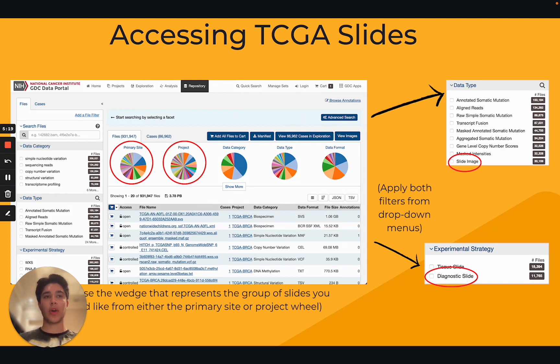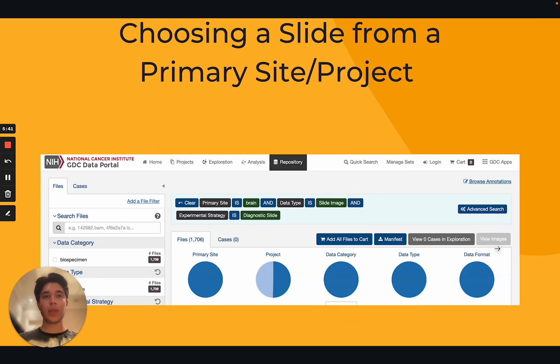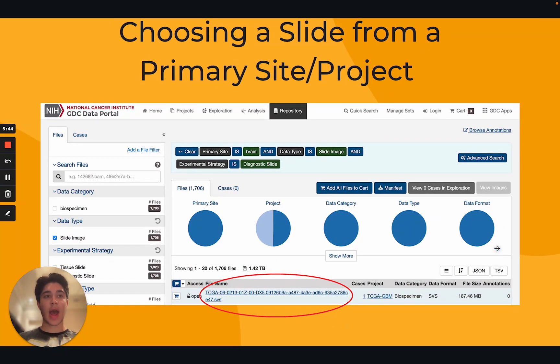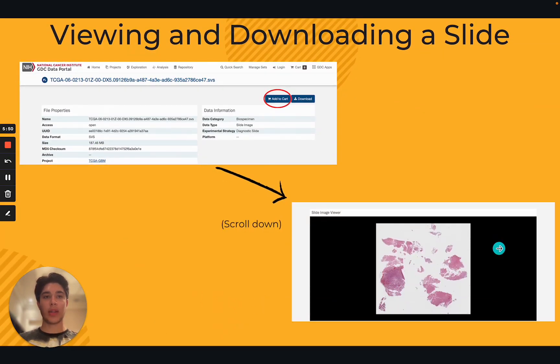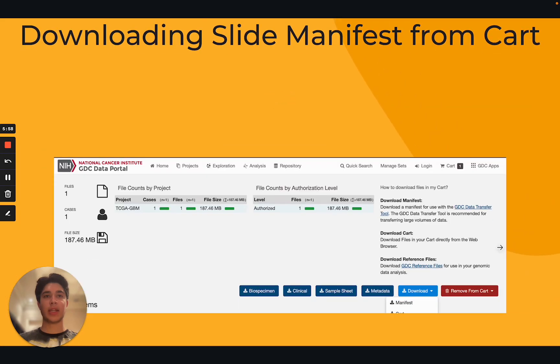For the purposes of this video, we will click on the blue wedge of the primary site wheel labeled 'brain' to view the complete group of pathology slides associated with this region. After choosing your primary site or project, simply click on the case ID of a slide you are interested in — the series of letters, numbers, and dashes ending in the .SVS extension — to view this slide. If you are still interested in downloading it after viewing it in the slide image viewer, click the blue 'add to cart' button in the upper right corner. You can add any additional slides you would like to download by repeating this process.